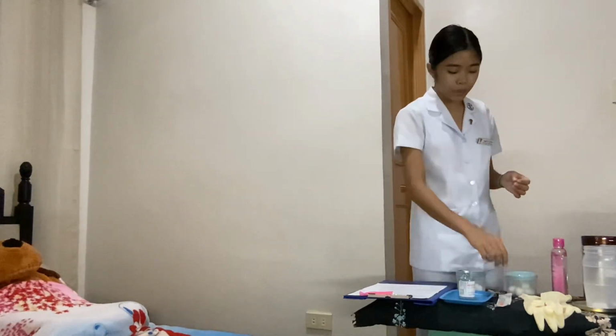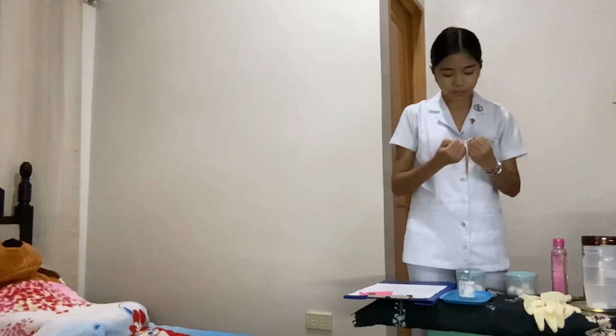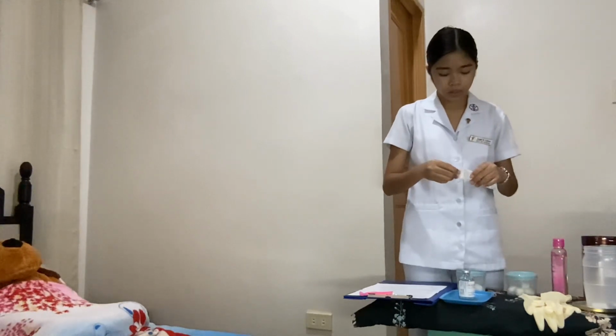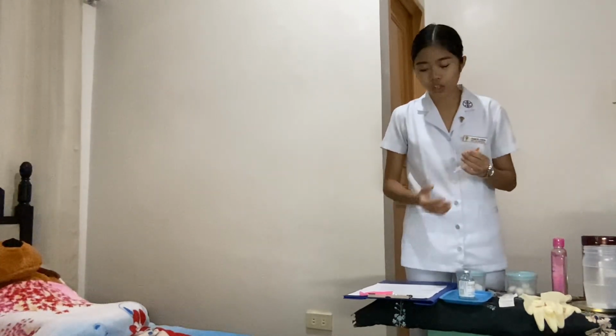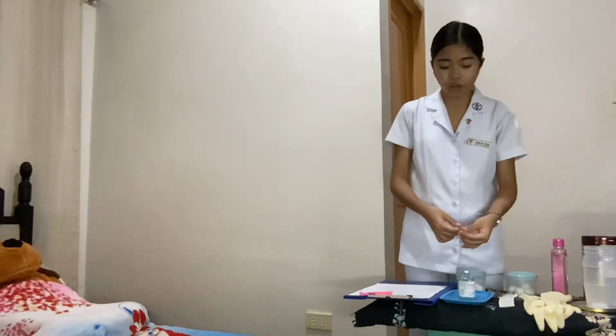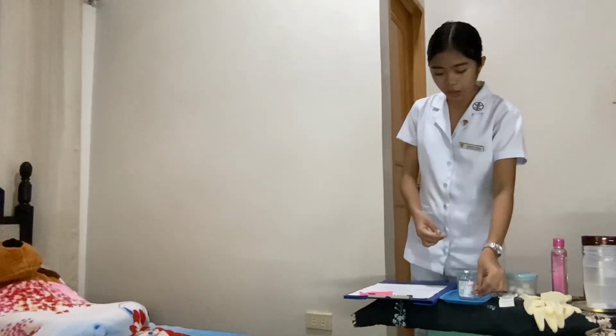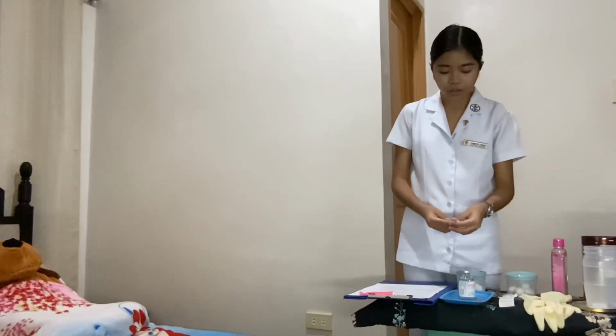After that, we're going to take out our insulin syringe. And then, since we're going to administer 0.4 cc or 0.4 ml of the medication, which is according to the patient's doctor's order, what we're going to do is to draw the same amount of air as the dosage that you'll be administering to the patient.